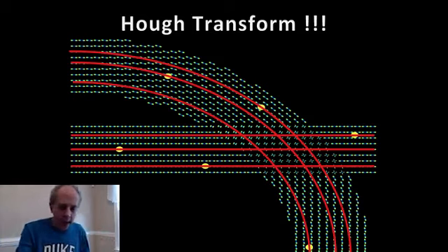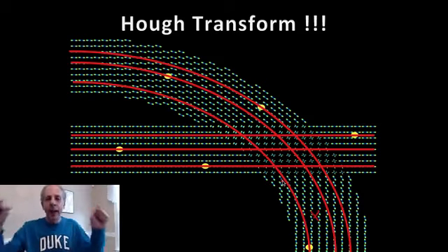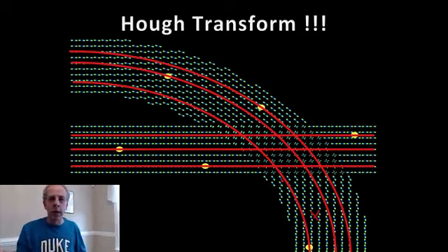And then you say, is this point connected to a point, let's say, here? If there is not a strong cable, a strong curve, then you say they're not connected. You can actually make a binary decision, yes or no, or you can make a probability decision. Oh, this is the probability that they're connected. And the probability is, as in the Hough transform, the addition of the local probabilities at each voxel, in the same way that when we were detecting circles or straight lines, we were asking basically what the chances were that this straight line had many local edge detectors along its way.